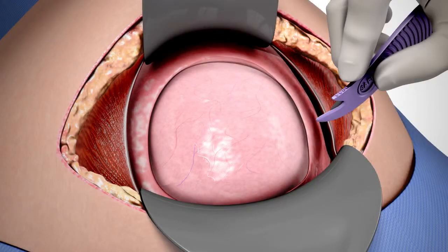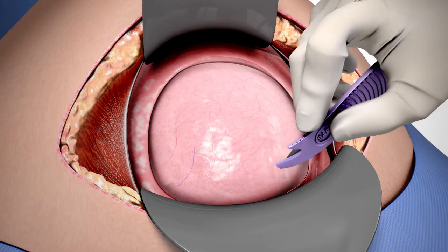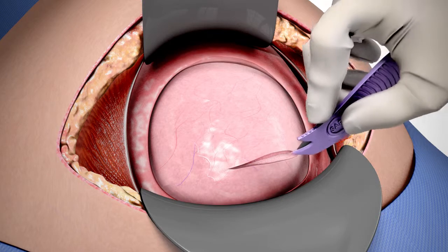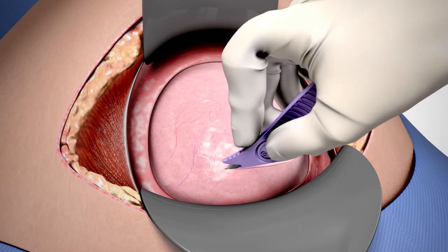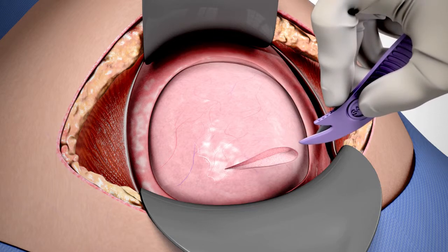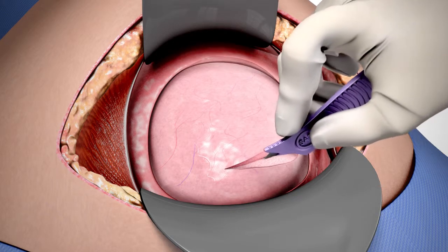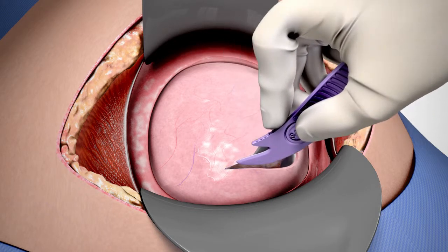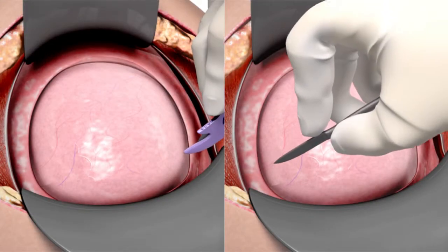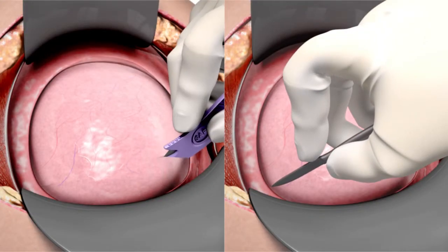If the uterine wall is unlabored or thick, several passes can be made. Because the serosa and myometrium vary in thickness, texture, and elasticity, the surgeon's approach with C-Safe must vary as well. When entry into the uterine cavity is achieved, the hysterotomy incision can be extended using C-Safe or blunt expansion with the surgeon's fingers.